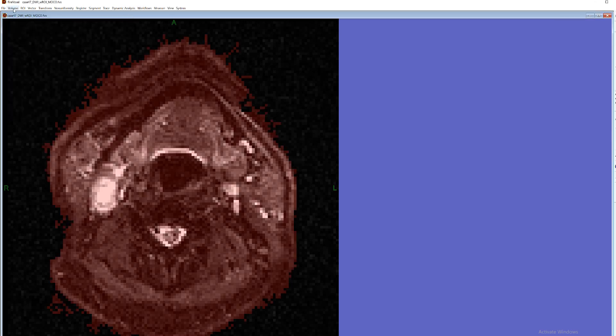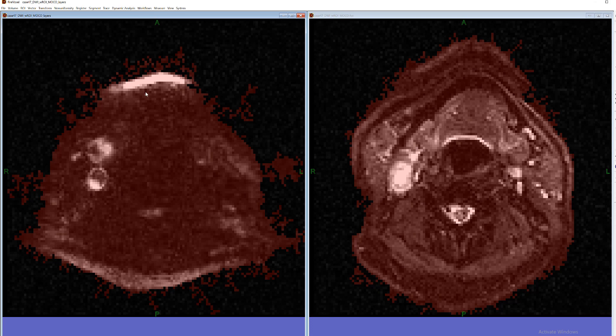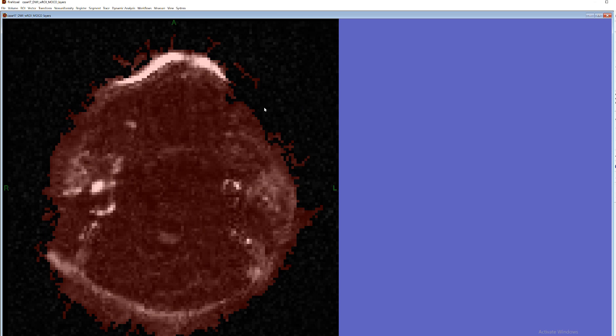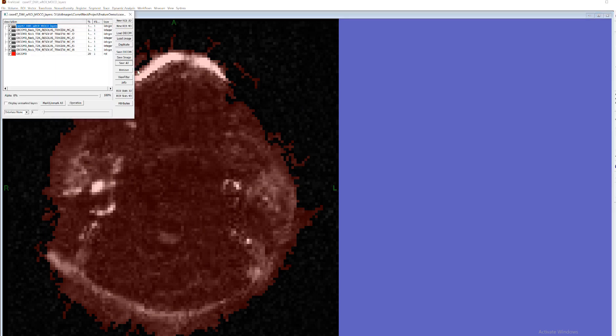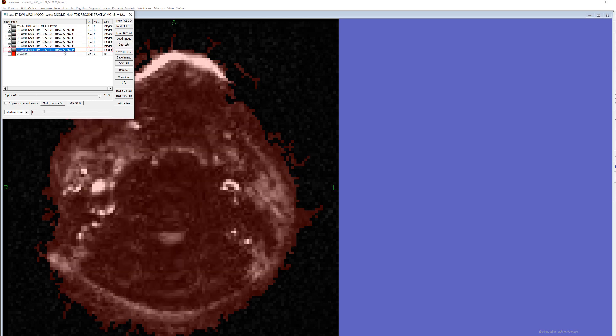If you go on the volume menu and here it's called split the volume into layers. There are no parameters. You just press and the new document appears.